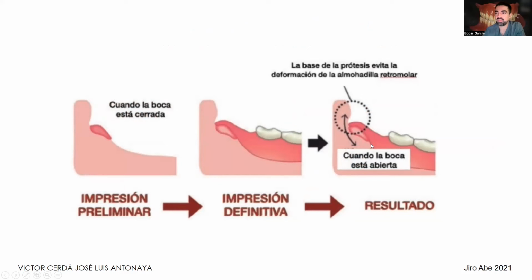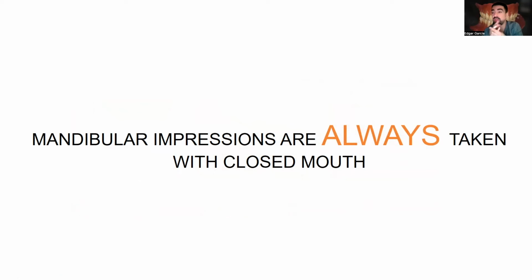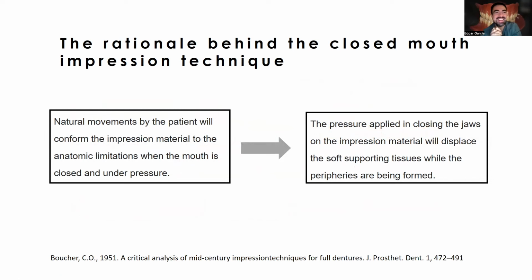So as I told you, we need to copy the retromolar pad, not only copy it, but copy it the correct way, with the mouth closed. So mandibular impressions are always taken with the mouth closed, but this is not something new. This is not like, oh, we discovered it 2 years ago. Boucher, 1951. The rationale behind the closed mouth impression technique: natural movements by the patient will conform the impression material to the anatomic limitation when the mouth is closed and under pressure.